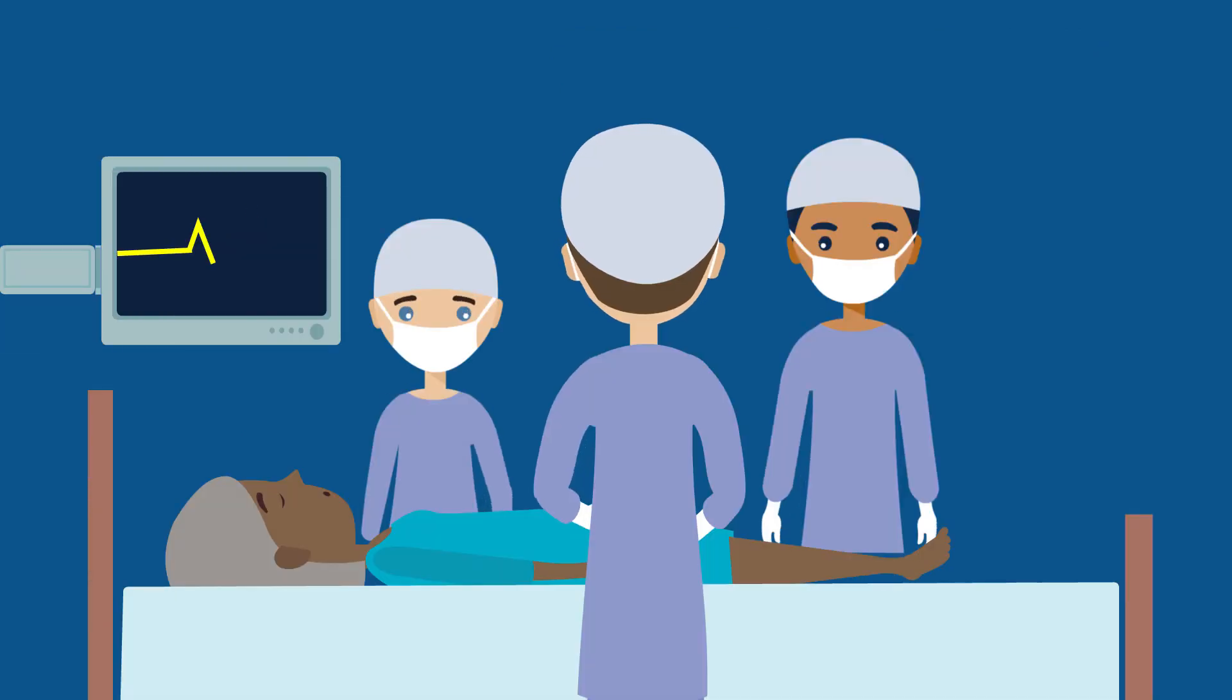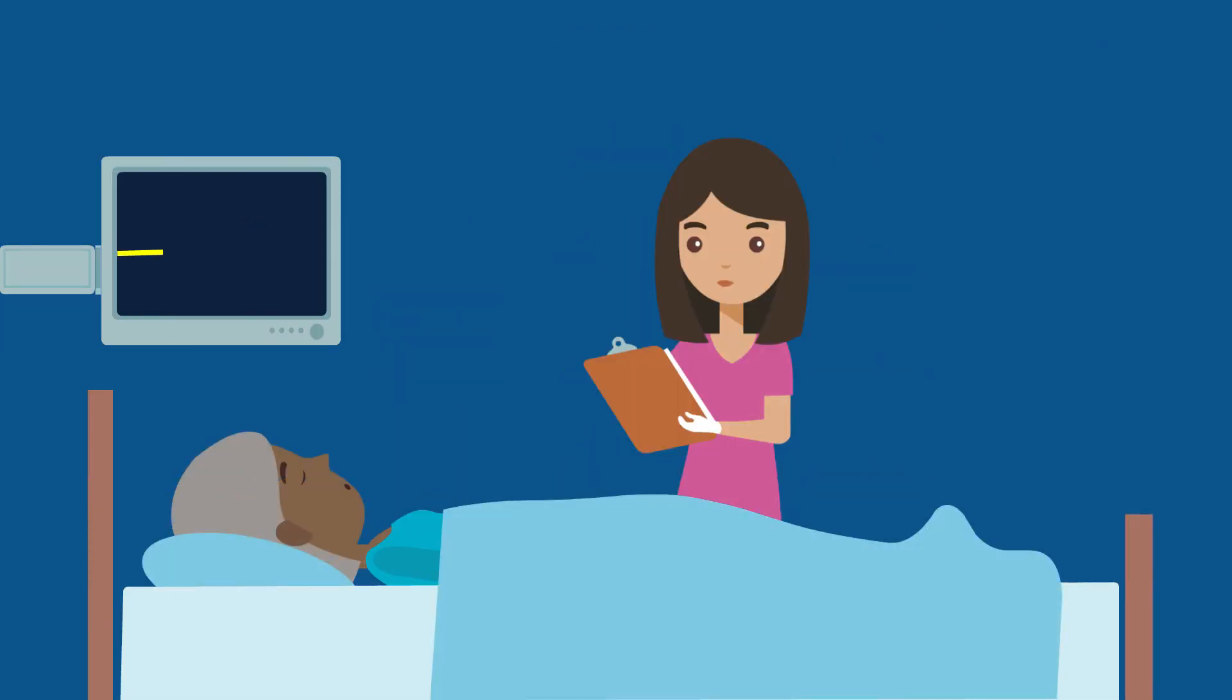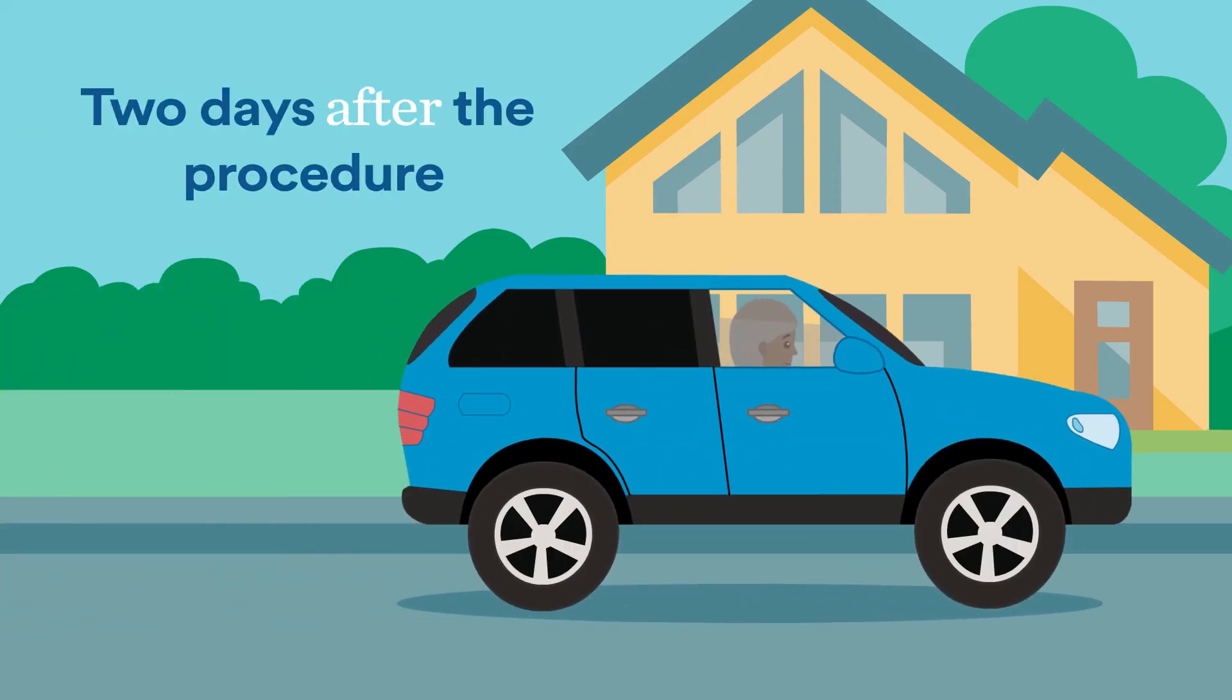Your medical team will monitor blood flow to and from the heart during and after your procedure. Most patients are home two days after the procedure.